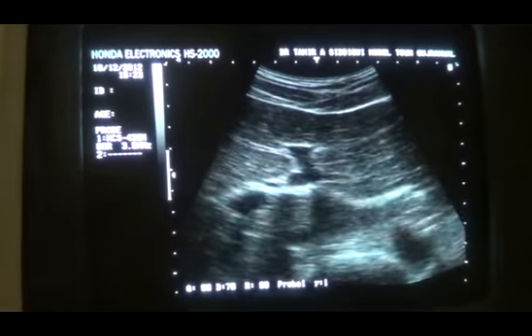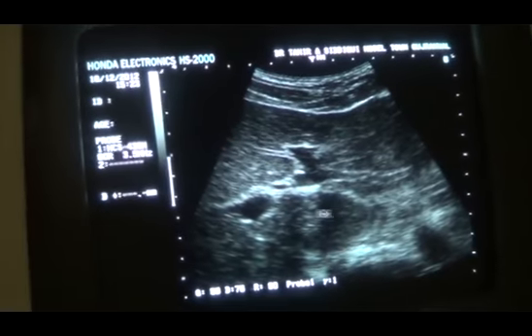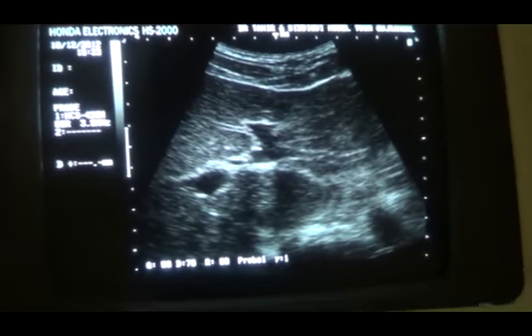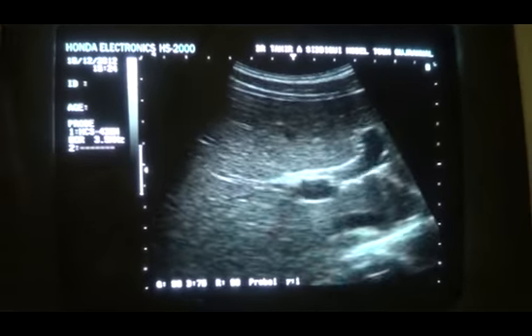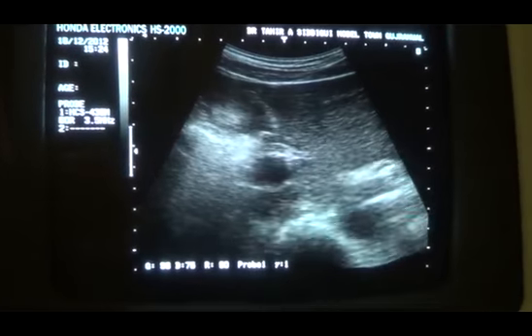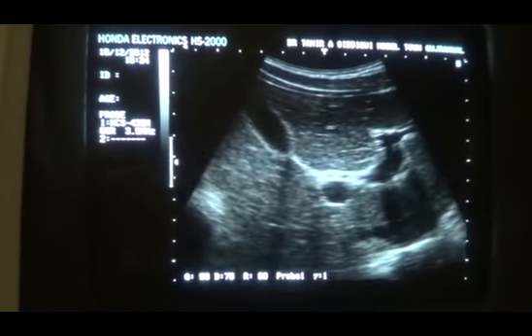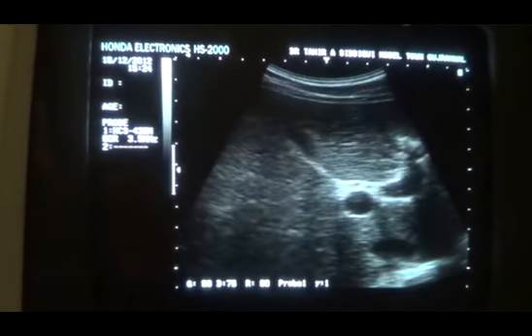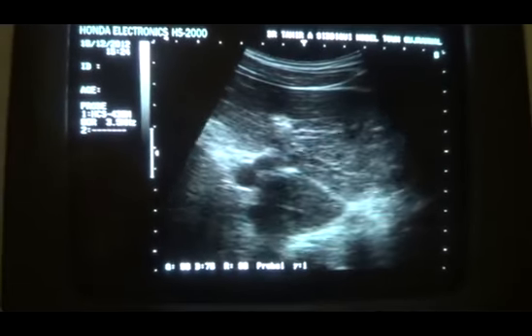Now, this is the Ligamentum Venosum, caudate lobe, left lobe of the liver in transverse section, ascending portion of the left portal vein. Now here you can see both the right and left portal veins together, with normal periportal echoes.